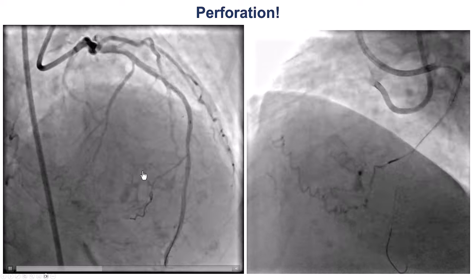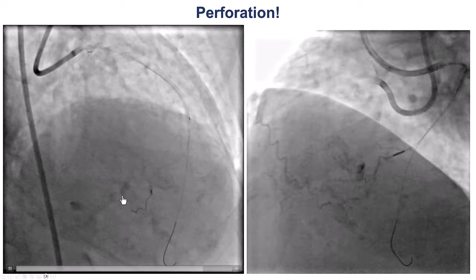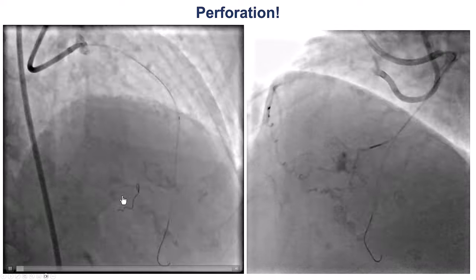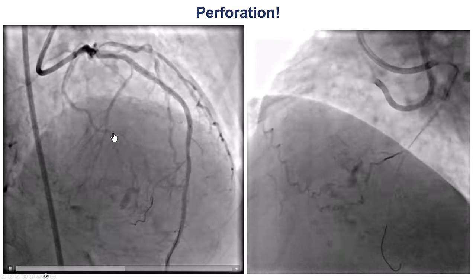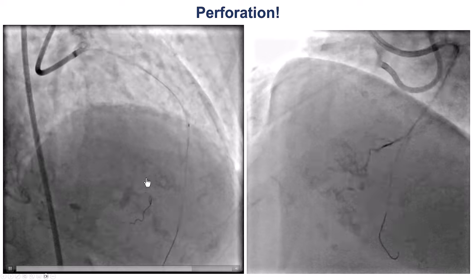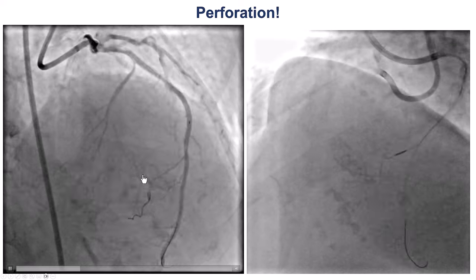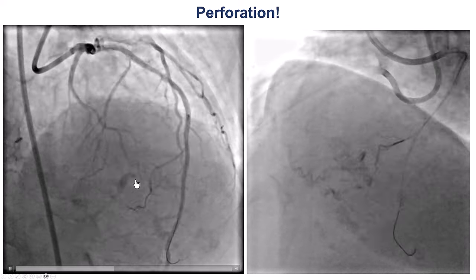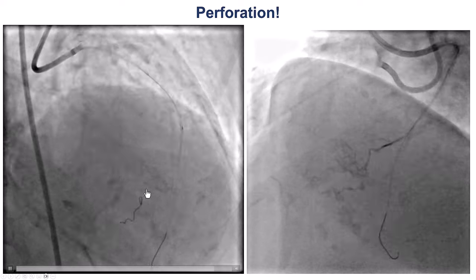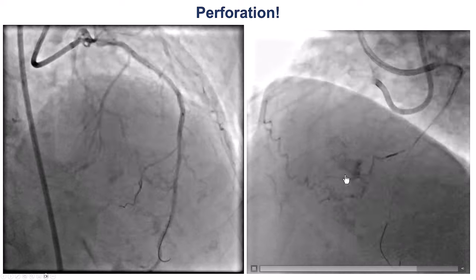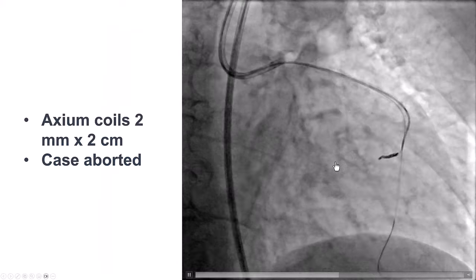We ended up having a perforation. This can happen sometimes if we don't look at the septals in orthogonal projections. This was actually not a septal but an epicardial collateral, and our wire perforated this epicardial collateral.